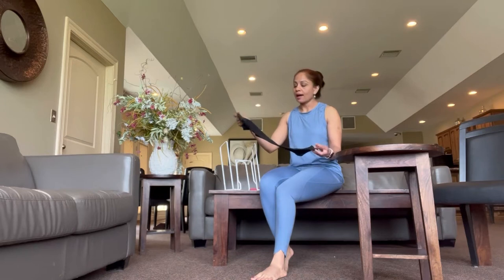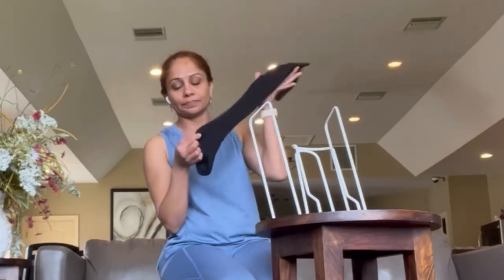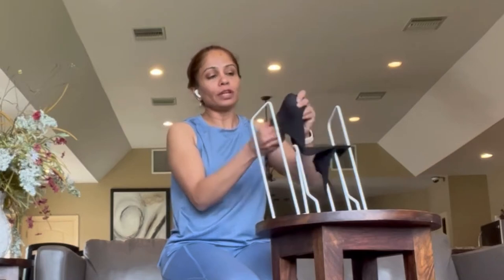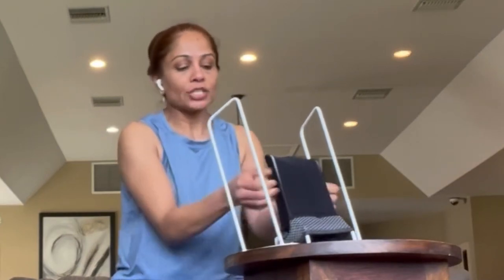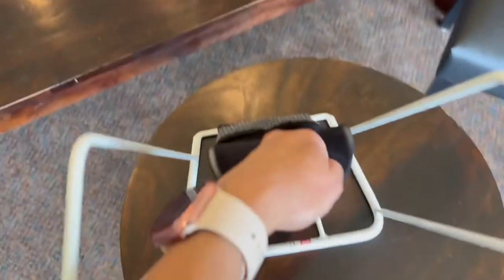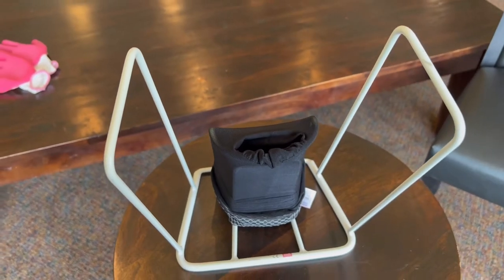I'll be showing you how to put this compression stocking on. I have a thigh-high compression here and I'll be using the small Butler. Put the Butler on a table so the back part is facing you. Take the sock and find the heel — the heel will come on the back of the frame right here. Once you figure that out, turn the sock inside out and start putting it on top of the frame, keep going until you see the heel. Make sure you put your fingers inside so the fabric is straightened out and not crumpled.